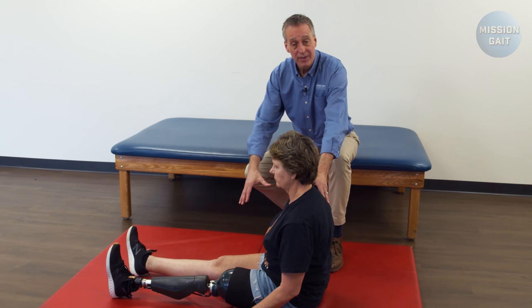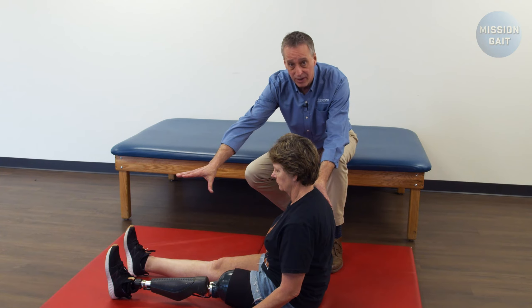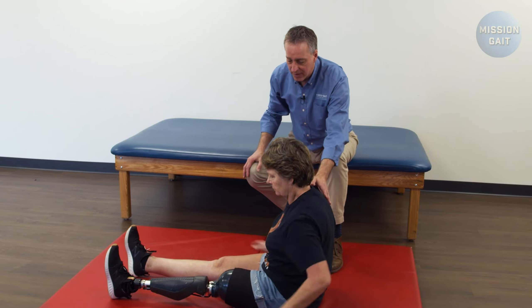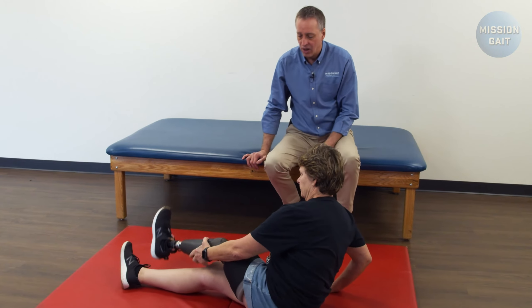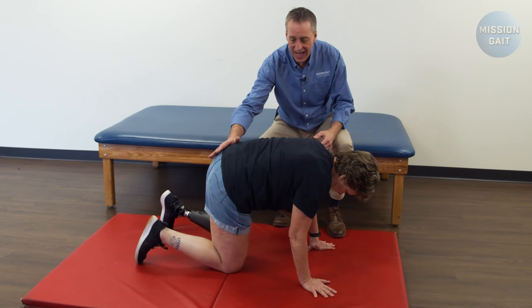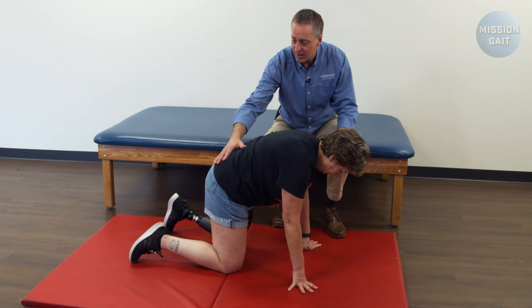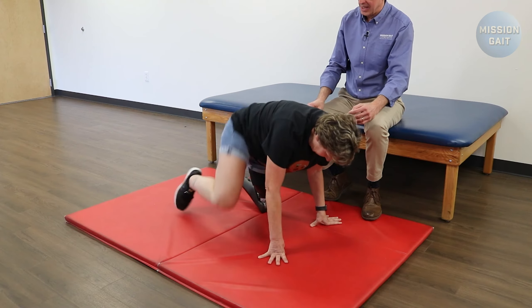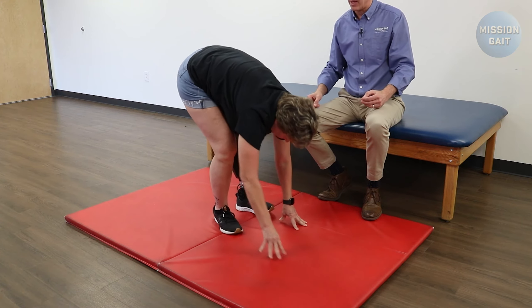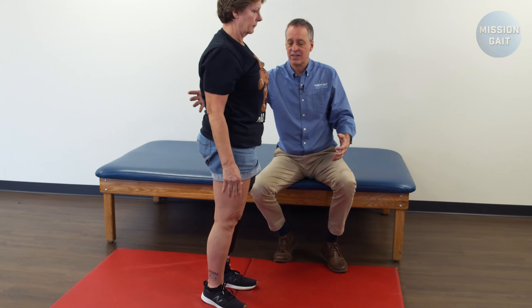If the patient has fallen and there is nothing around them to get a hold of, they're going to go from this same position — checking their feet to make sure the prosthetic is on correctly, then cross your leg over and get onto your hands and knees. From there, if there's nothing to hold onto and she needs to get up in the middle of the floor, she's going to bring her right foot forward into a stable position, press into her hands, bring her leg underneath her, and press up into a standing position.